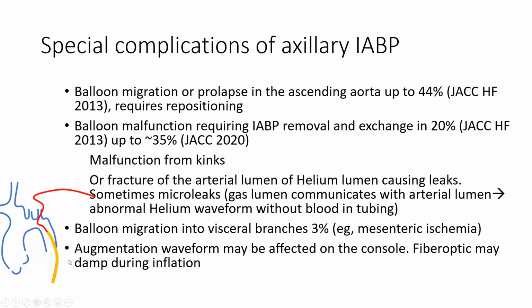Another idea not much talked about is that the fiber optic tip is here. So you're getting your waveform from the distal aorta on your balloon pump waveform on the console, not from the ascending aorta. So each time the balloon inflates, actually your fiber optic line may damp rather than augment. Now the ascending aorta is augmenting, but the descending aorta pressure may damp. So you may not get a proper augmentation waveform.